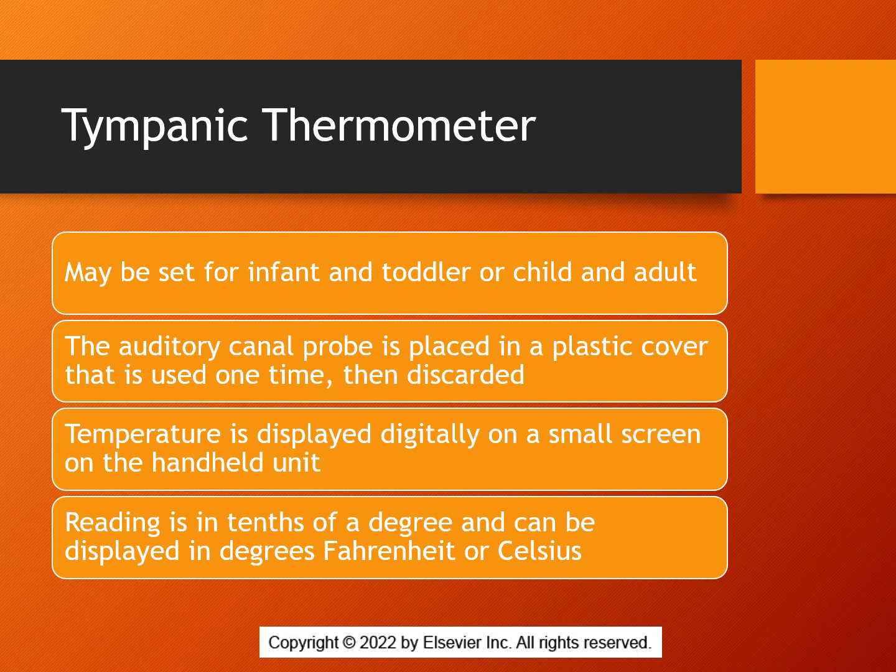Tympanic. This is put into the auditory canal. It has a plastic cover that covers it. So again, it has that disposable cover, so you can use it from one patient to another. Change that little plastic cover, and the temperature is displayed digitally.